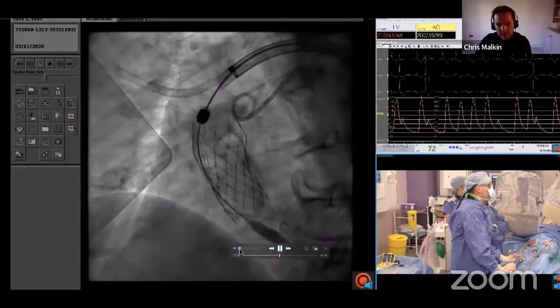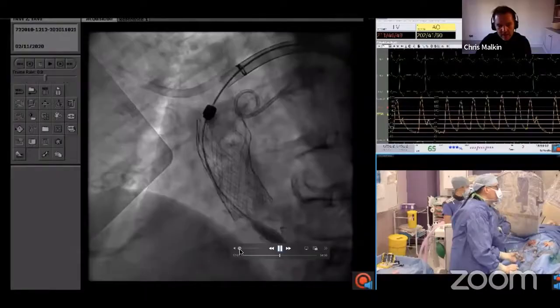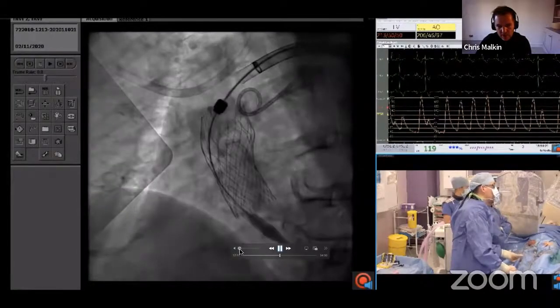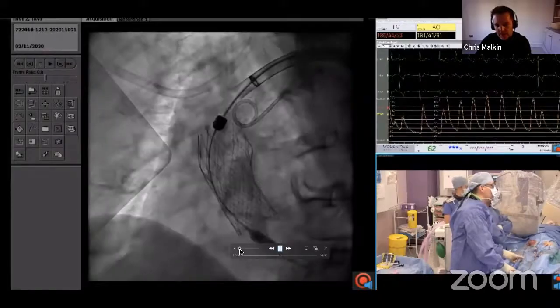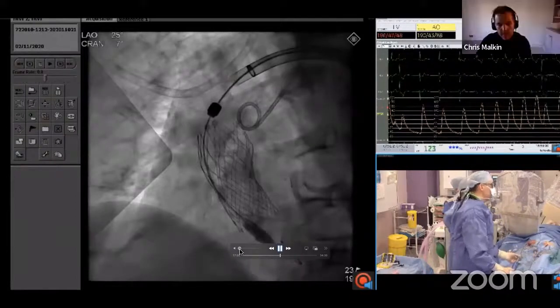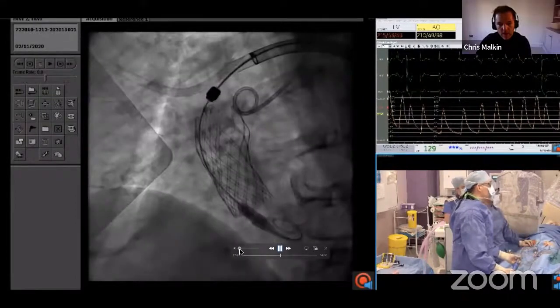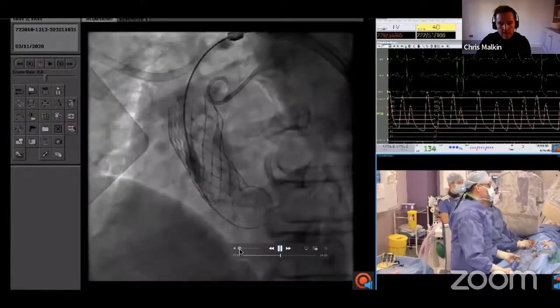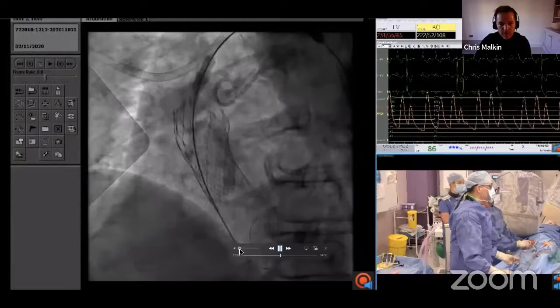So the worst thing to do at this stage is to pull it out just in case it's engaged in the top of the cell. So actually it is off, but the thing to do is actually to rotate the catheter and eventually it just comes free by itself, as you can see there. Again, there's no rushing at this point. You can only adversely affect what should be a perfect result.